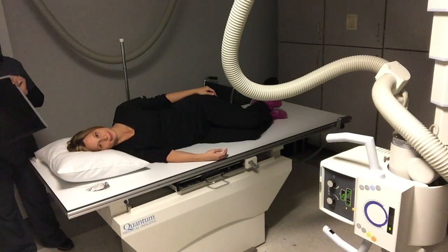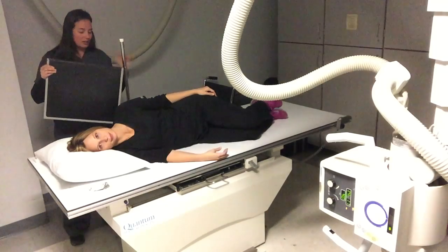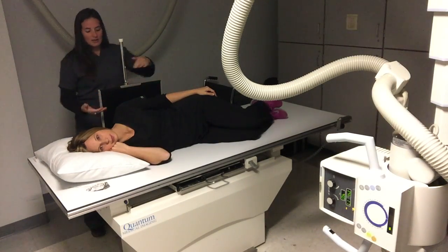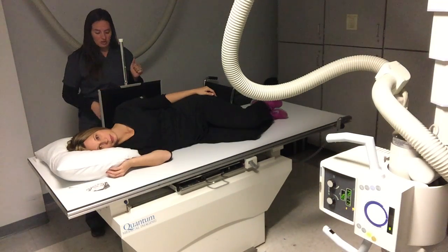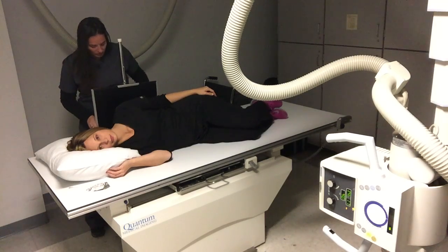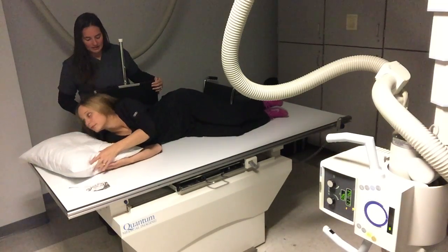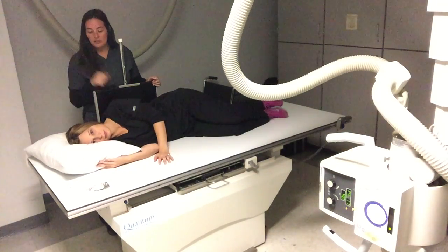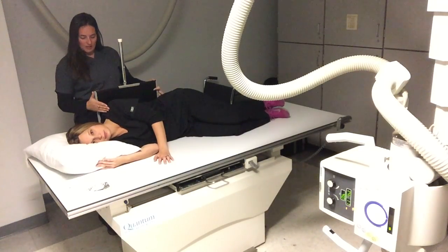As I line it up, I'm putting this cassette in the cassette holder behind her with my red line at the bottom, in a lengthwise orientation — because for my patient that's what works. If you have a wide-chested person you would put it in crosswise, but always remember your red line should be at the bottom. I'm going to have my patient scoot back until she's touching the cassette, placing it an inch and a half to two inches above her shoulder, just like we do at the wall Bucky. Typically I would also be using a grid.